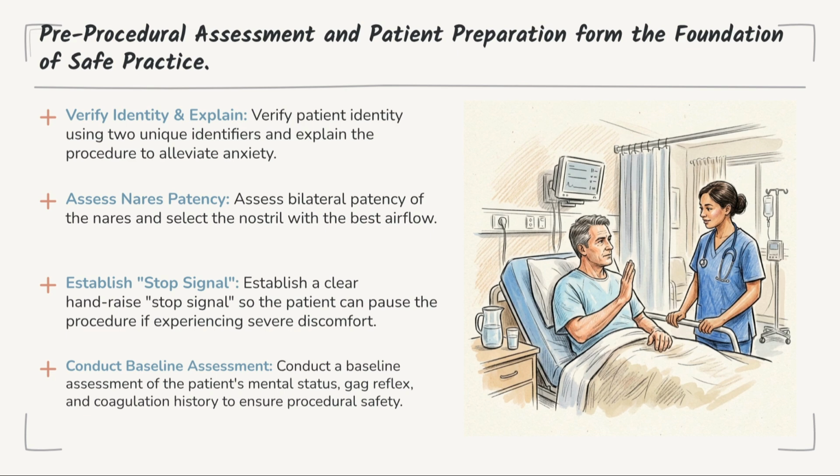Always verify patient identity using 2 identifiers, and clearly explain the procedure to reduce anxiety. Assess nares patency to choose the best nostril. Establish a clear stop signal for patient comfort, and review the patient's medical history before beginning.